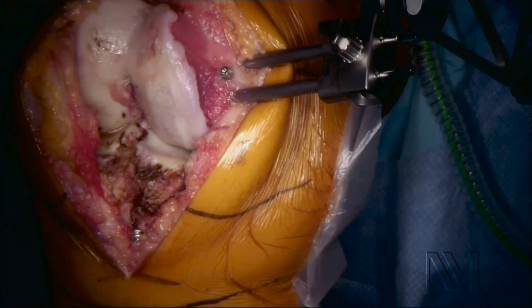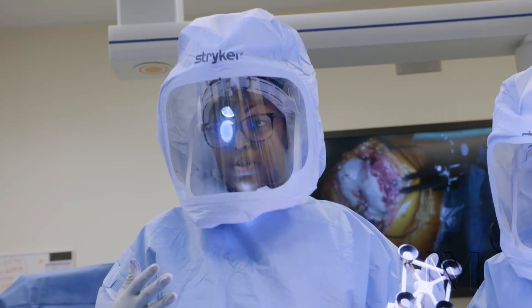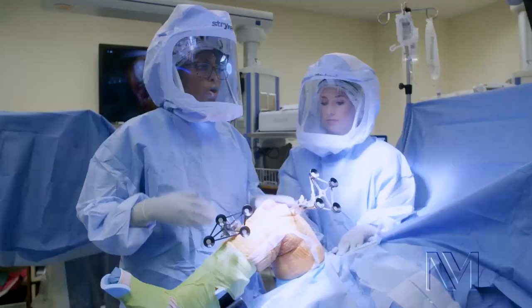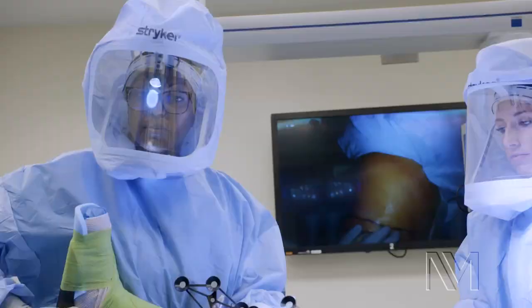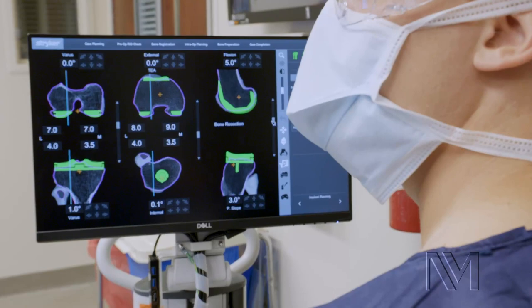So now this is probably the most important part of the surgery — balancing the knee. This is where the robot really becomes so useful in doing a knee replacement. We need to know what the range of motion is of the knee as well as what the balance is. In the setting of arthritis, one side of the knee becomes tighter, one becomes looser, and ultimately the robot is giving me more accurate information on the actual degree of getting to full extension.